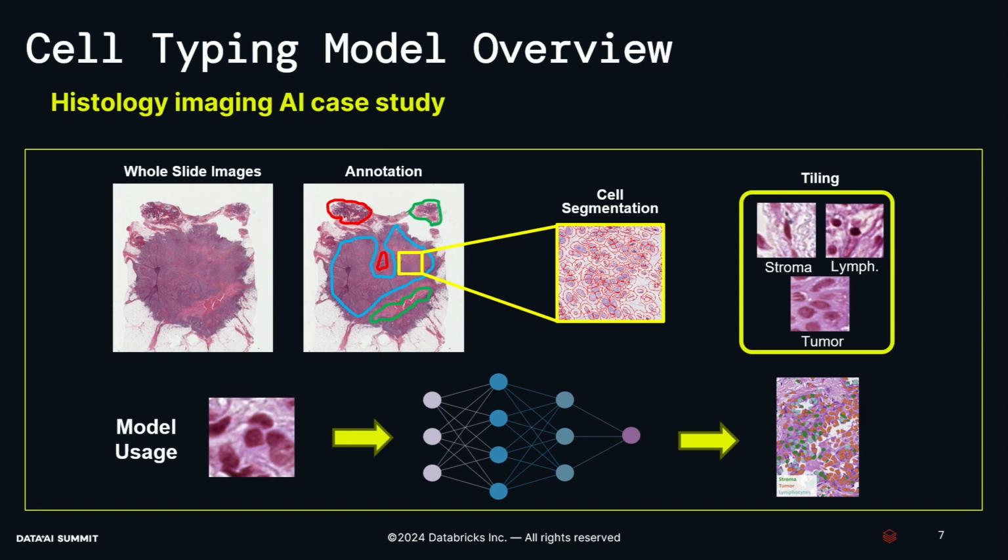And in general, what happens is you'll split that whole big whole slide image, which is a gigapixel image. There's like 30,000 regular sized images in that image. And then we'll split those into tiles and we'll send them through a pipeline that finds the cell centroids. We use StarDist for that. That's a whole deep learning program that's just in our pre-processing.